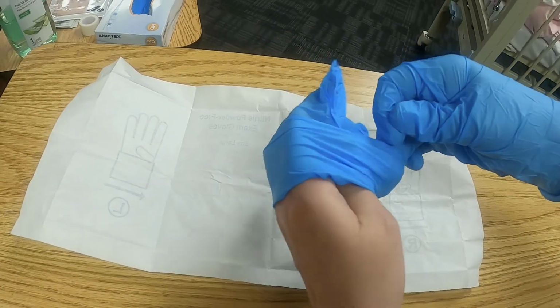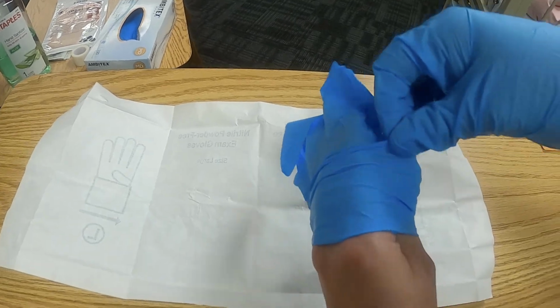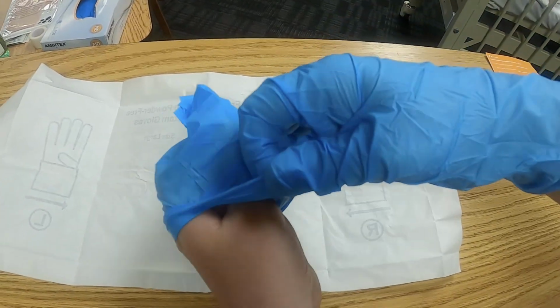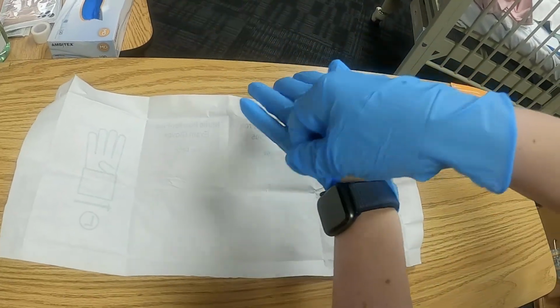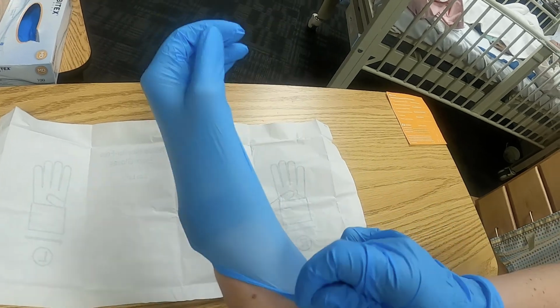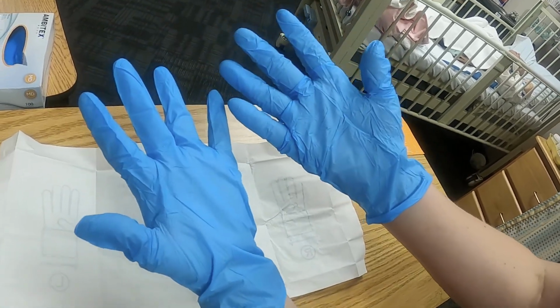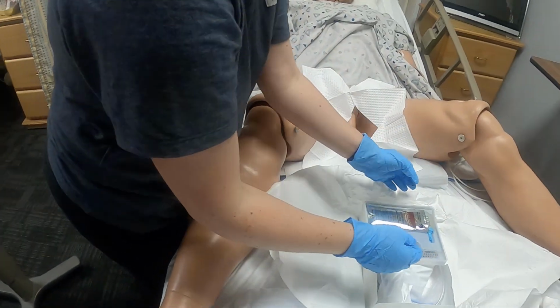There we go. And it doesn't matter which way your fingers go in there first. You will fix it as you go along. There you go. And in those cases, they're always big. Okay? All right, coming over here.